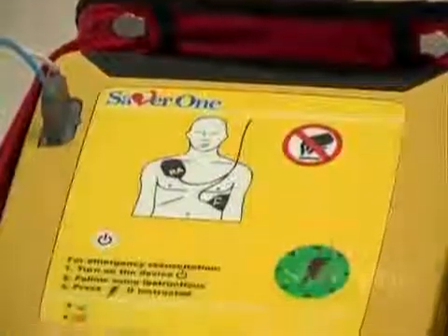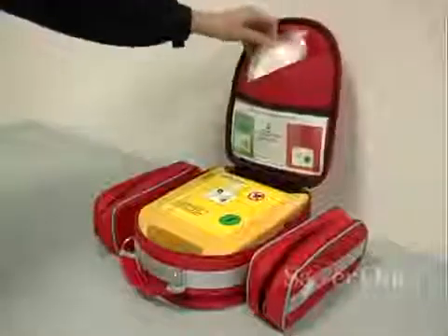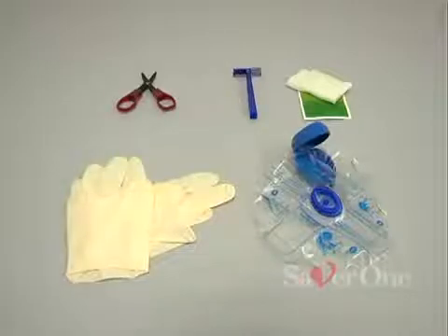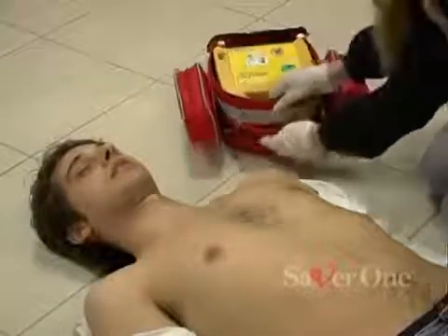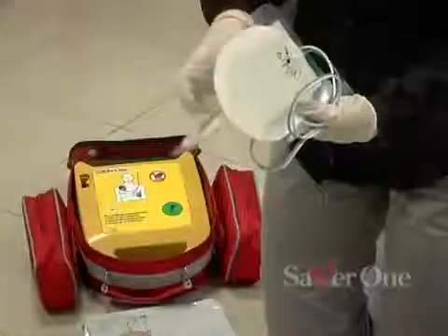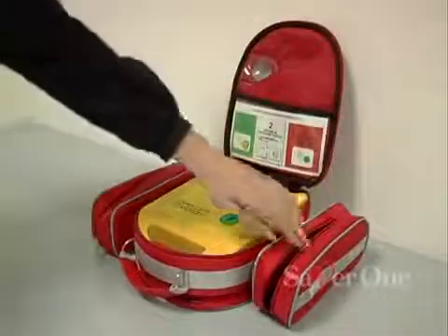The main steps of the use of the Saver One: behind the quick reference card in a pocket is the patient's preparation set consisting of scissors, razor, napkin, gloves, and disposable mask. The electrodes are in the back pocket of the bag.